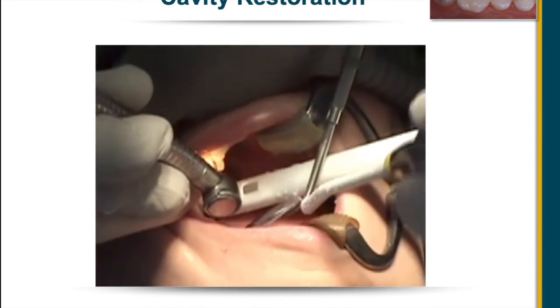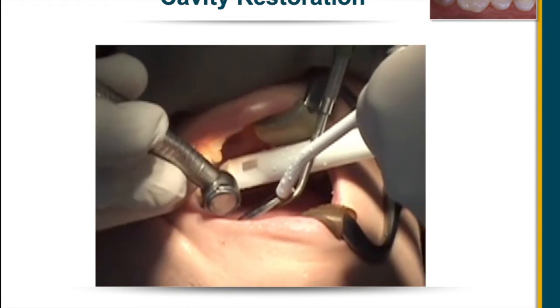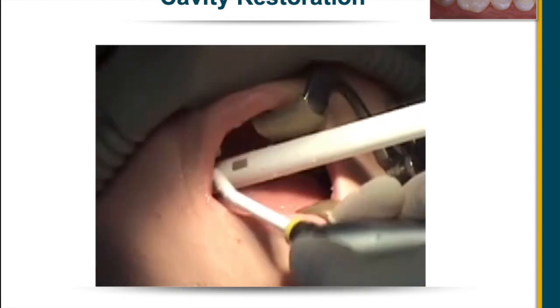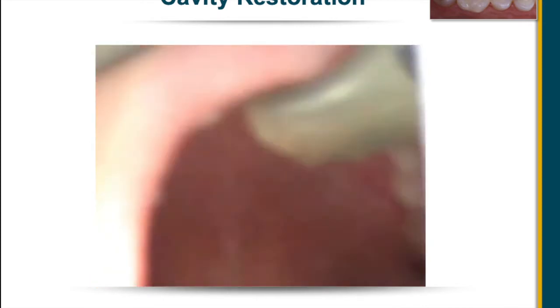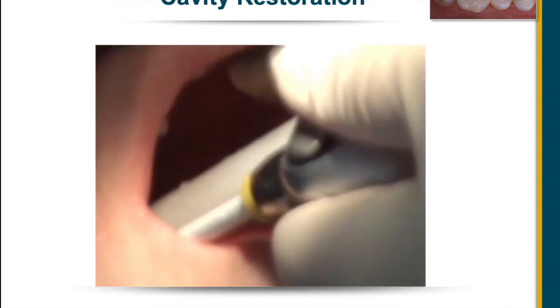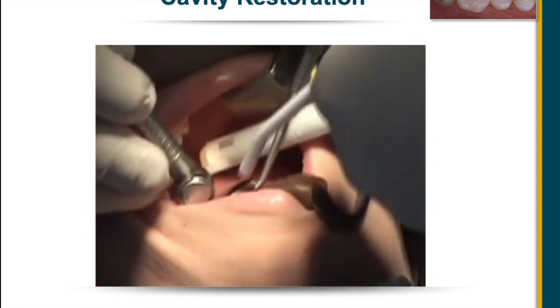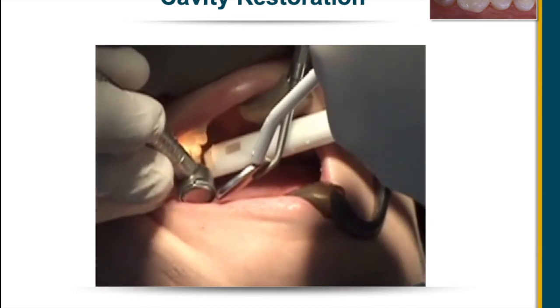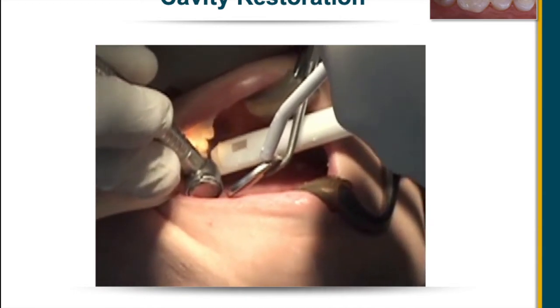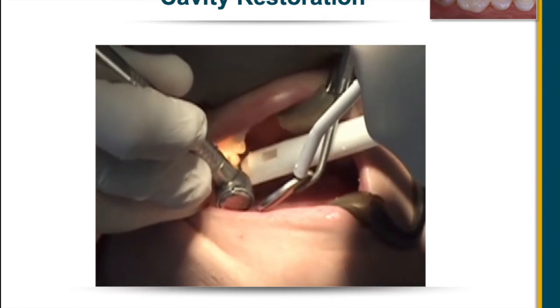One of the biggest mistakes that the assistant makes is assuming that when the doctor is done, the assistant is done. In fact, that's just the opposite. When the doctor is done, the assistant moves in, washes, rinses, dries, suctions the patient's throat, and gets the area ready for observation by the doctor. So as soon as the doctor is finished, it's now the assistant's patient, and the assistant should take over and prepare for the doctor to return.